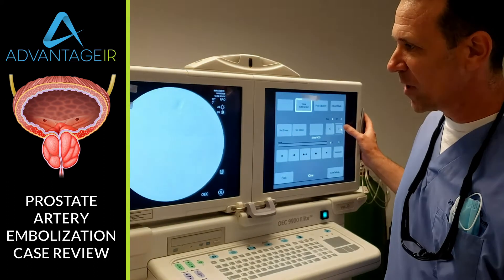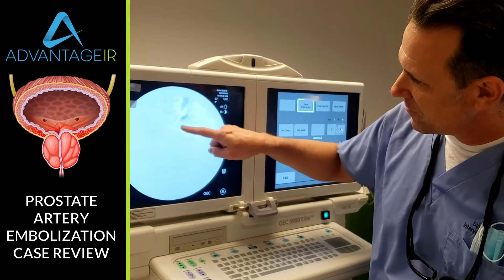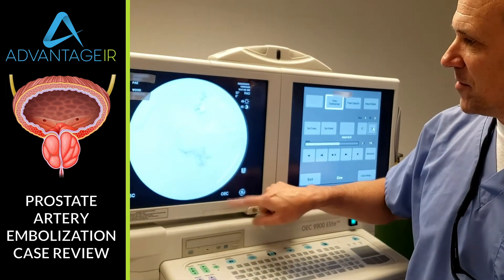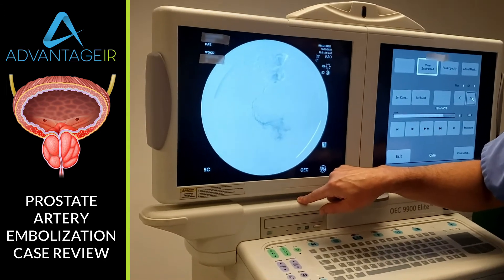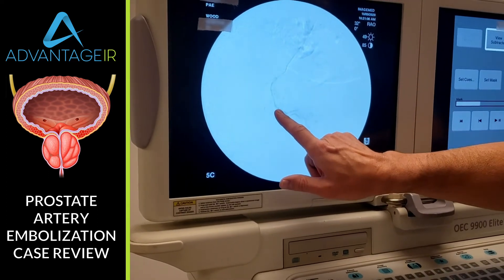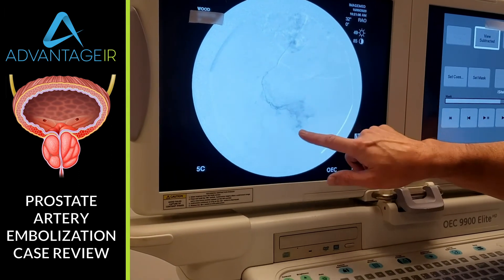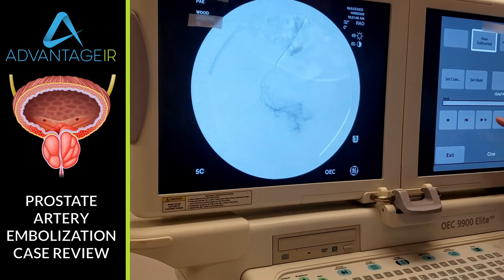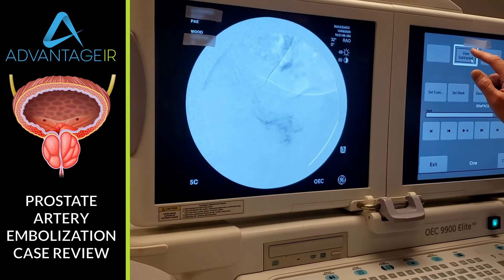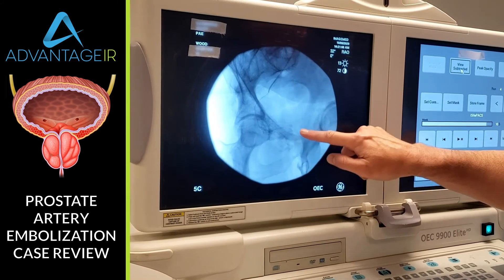We're going to send a little microcatheter into that right prostatic artery. Now we've got a little microcatheter that's gone deep into the prostatic artery. We're injecting contrast dye. This is a pretty small artery, so it's hard to see. There's the tip of the catheter, and this is the prostate. You can just see a little bit of contrast blush in the prostate there at the end. We can add and subtract the bones to help us see where we are — that's an ideal prostate location right there.